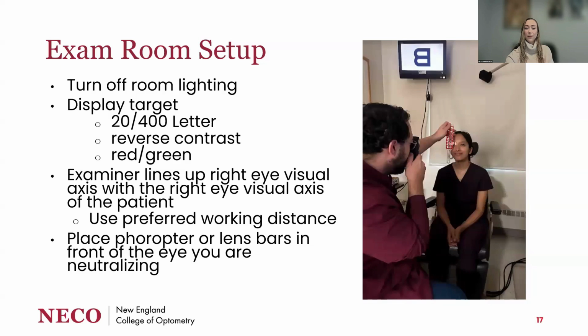And I do recommend the reverse contrast. It's not shown up here. We have the standard contrast with the black letter and a white background. The reverse contrast really helps to limit glare as well.